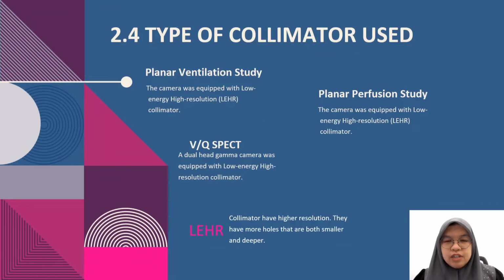I would like to continue this presentation on the topic of lung scintigraphy, for the type of collimator used. For lung scintigraphy, there are three procedures: the planar ventilation study, the planar perfusion study, and VQ SPECT.